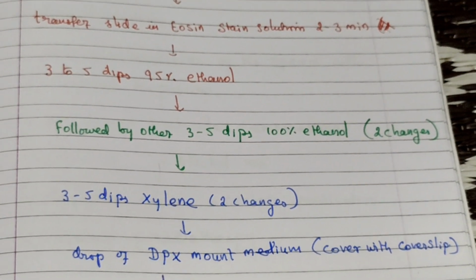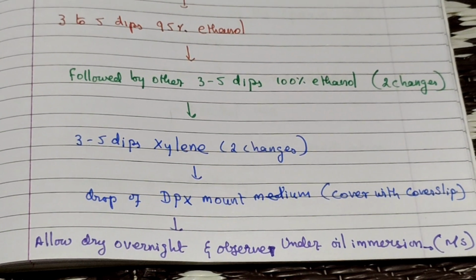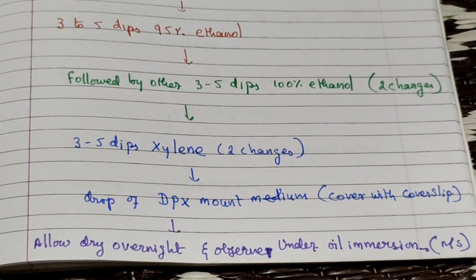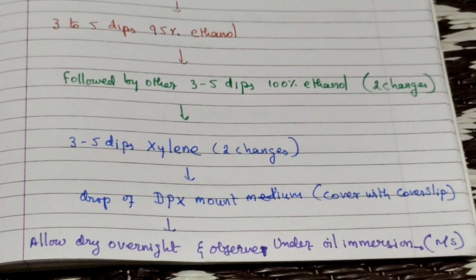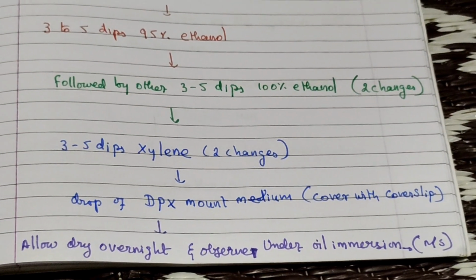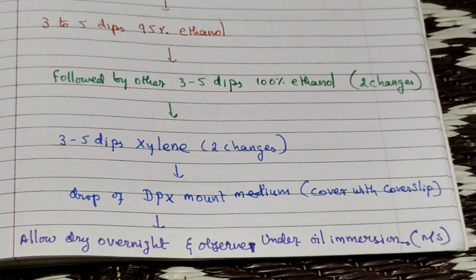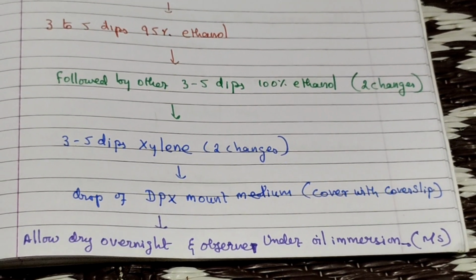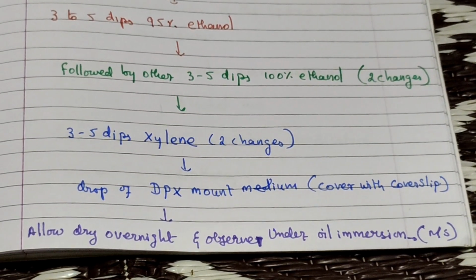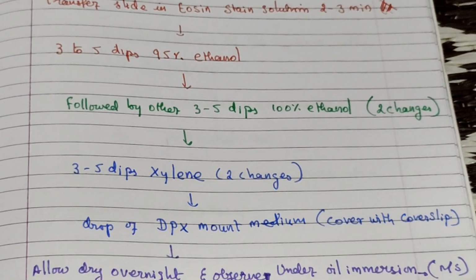Study the morphology of 100 to 200 individual sperm cells and assess the morphological defects of the various parts of the sperm. Calculate the fraction of abnormal sperm. A semen sample containing more than 30 percent morphologically normal sperm cells is considered normal. So more than 30 percent means a normal person. Abnormal sperm cells can be caused by various factors.